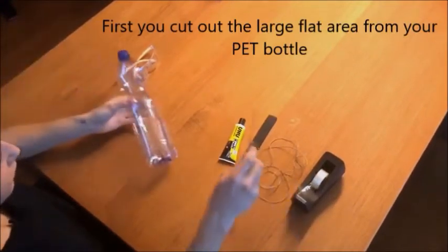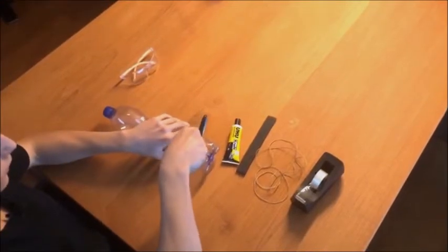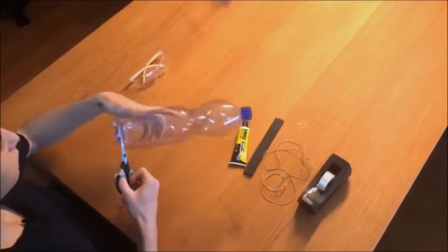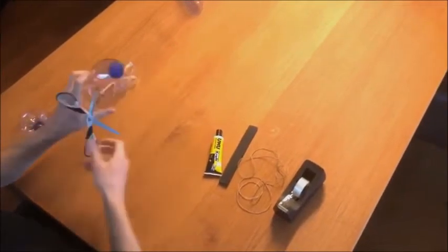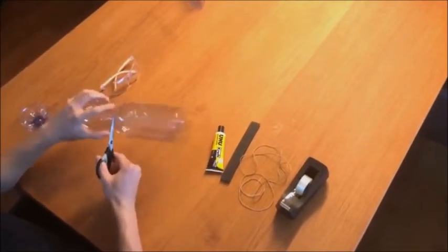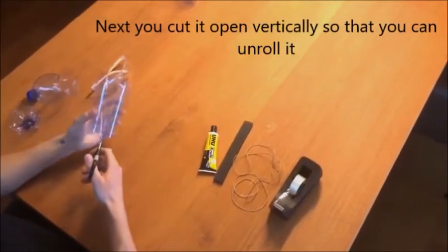First, you cut out the large flat area from the pet bottle at the top and the bottom. Now you cut it vertically so you can roll it.